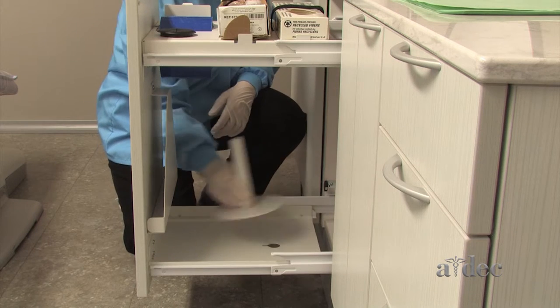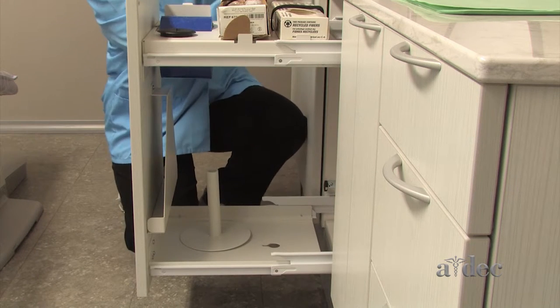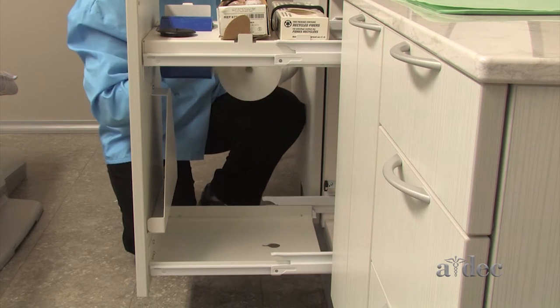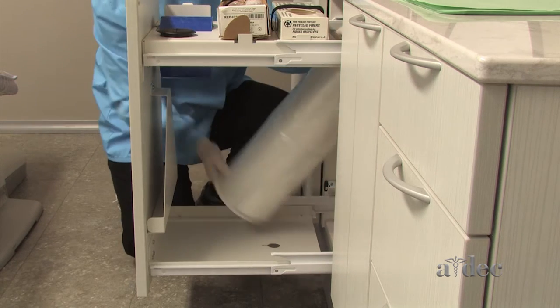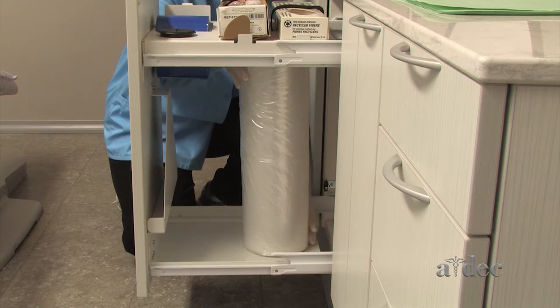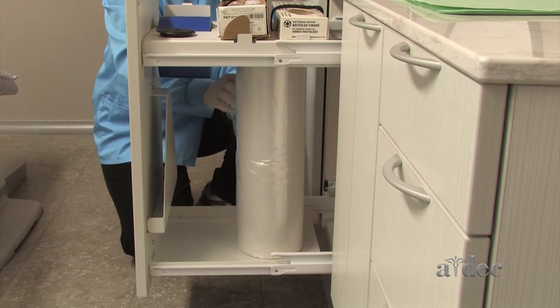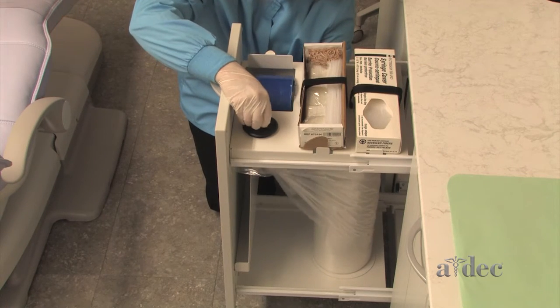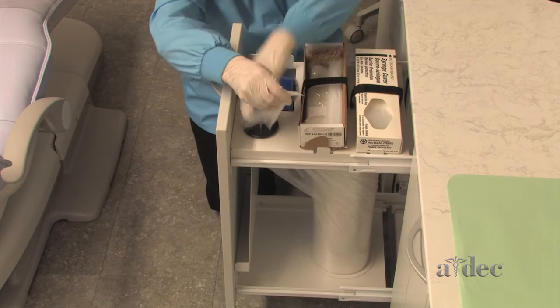The spindle holds a large roll of chair covers. Pull the covers through the opening in the top of the drawer.